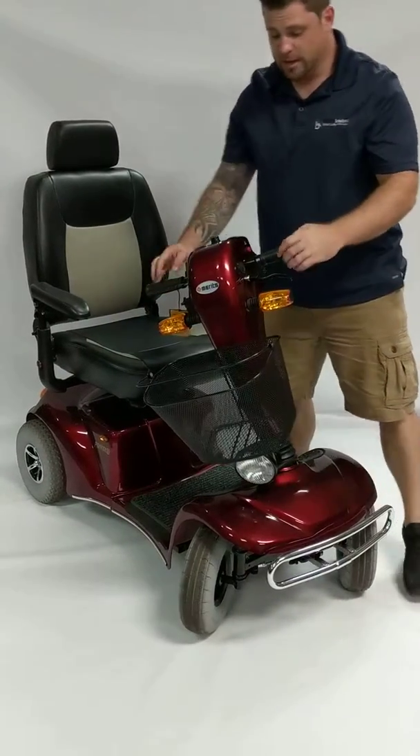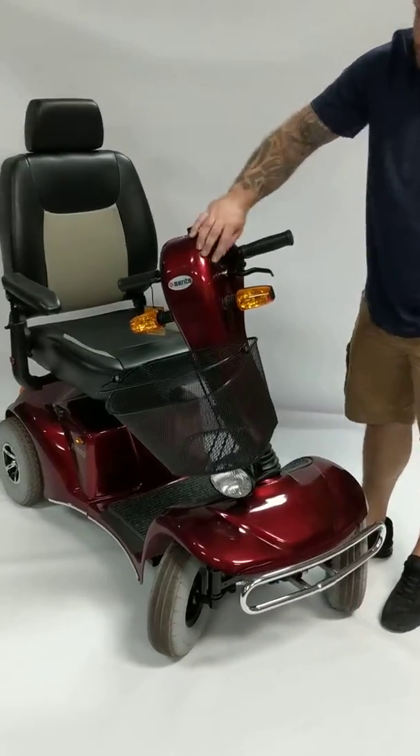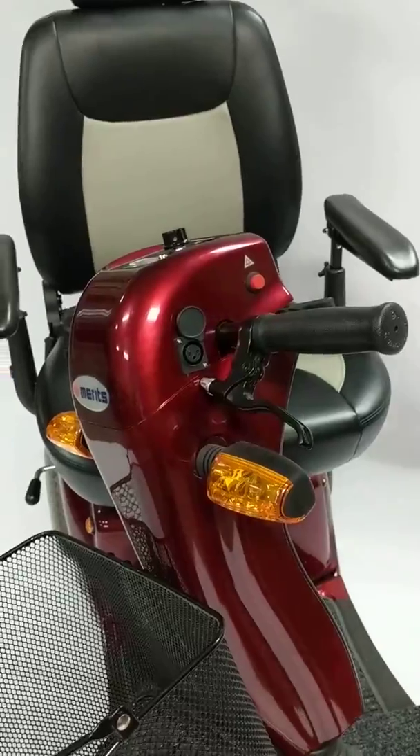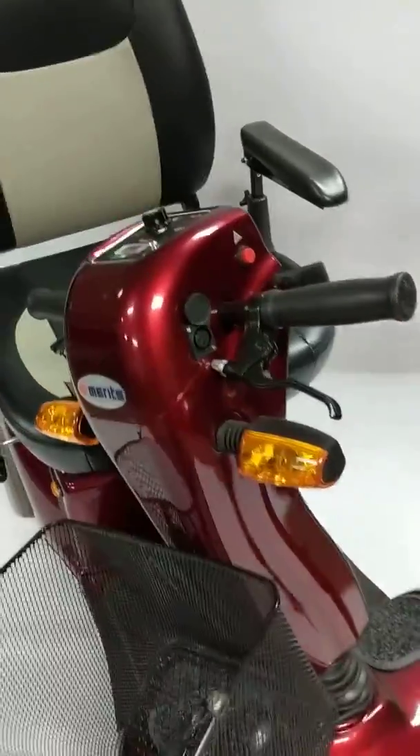This particular scooter is very easy to charge. The charging port is conveniently located on the side. You can stand up, get off your scooter and plug it in. It's an XLR off-board charger.